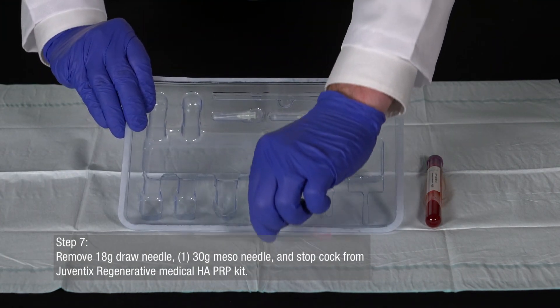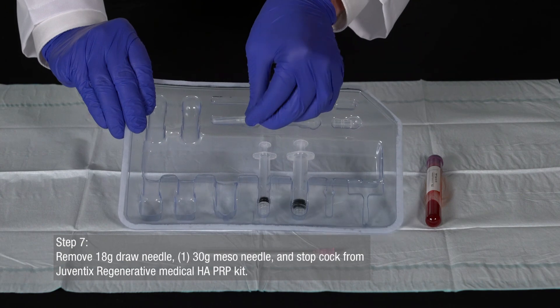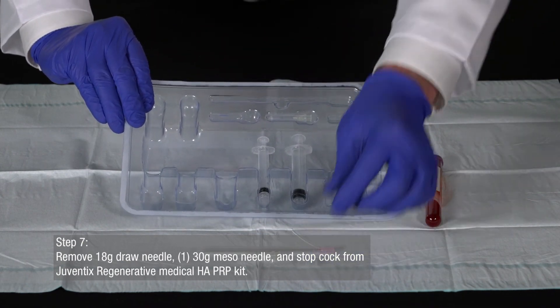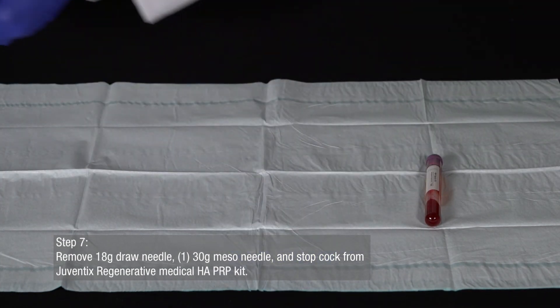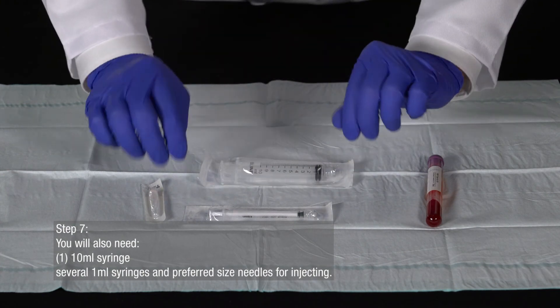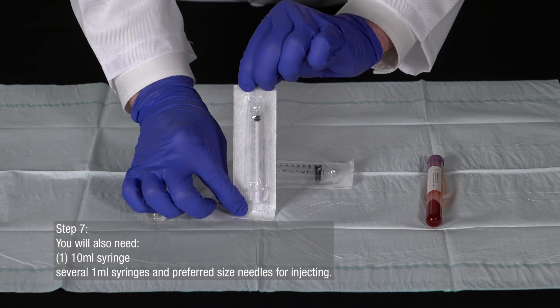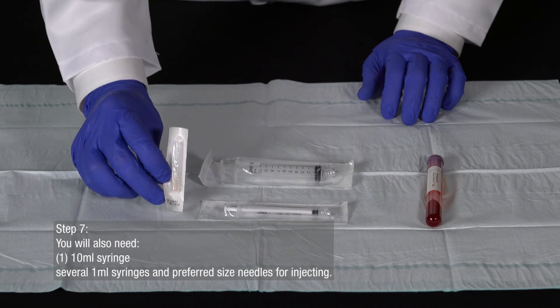Remove the 18-gauge draw needle, one 30-gauge mesoneedle, and the stopcock from your Juventix Regenerative Medical HAPRP kit. To prepare the hyaluronic acid and platelet-rich plasma for injection, you will also need one 10-milliliter syringe to draw the contents into, several 1-milliliter syringes to draw the prepared product, and your preferred size needles for injecting.